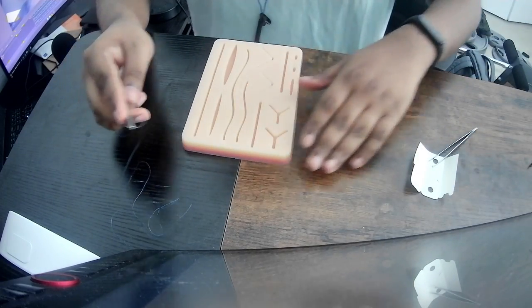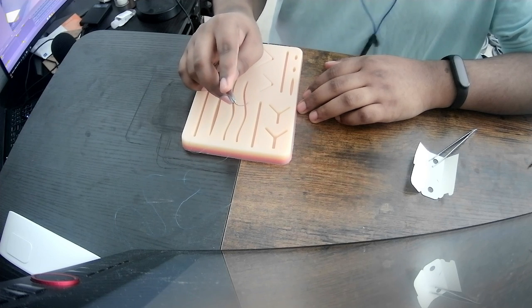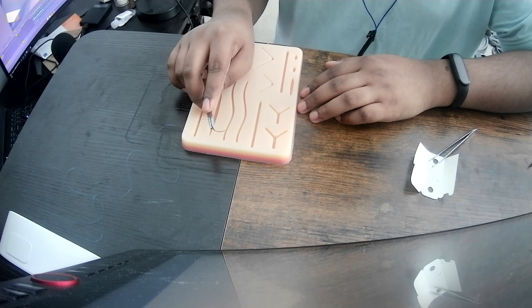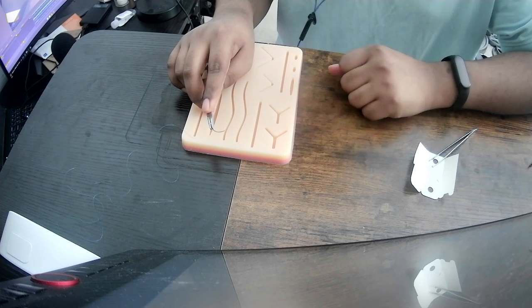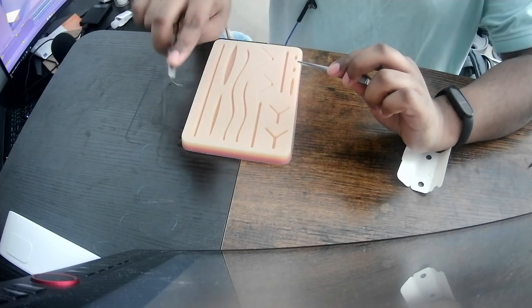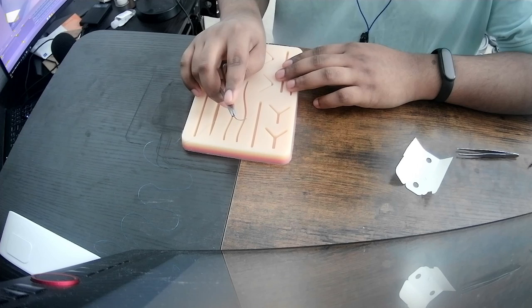So what I would recommend is trying to do something like this, and once you get really, really good with the towel, feel free to buy pig's feet as much as you want. My personal recommendation is to buy pork belly because it's large, it's flat, there's a lot of area, and you can cook the pork belly after you're done practicing suturing on it. This person is just saying the hardest obstacle to get started is the muscle memory of driving through the wound, picking it up, going back and forth, back and forth. So we've practiced handling our tools. We're comfortable doing that.